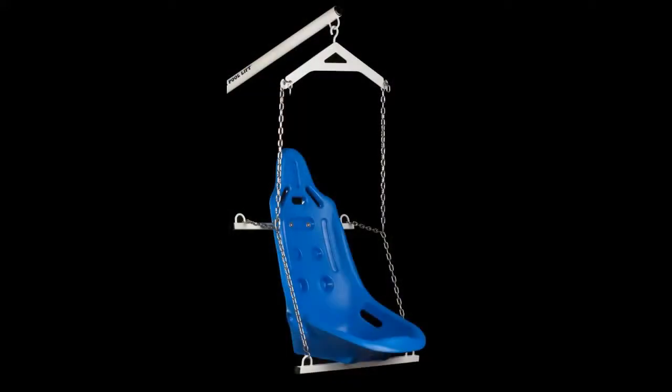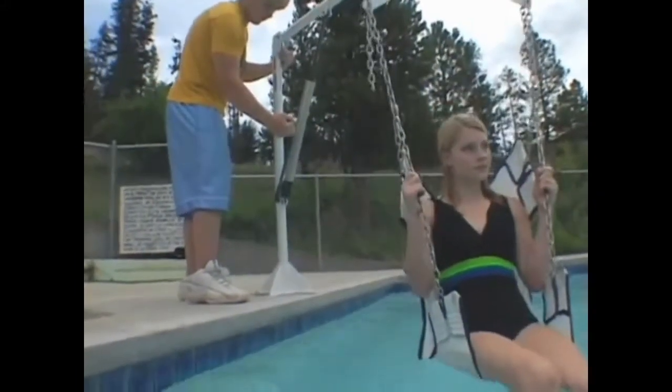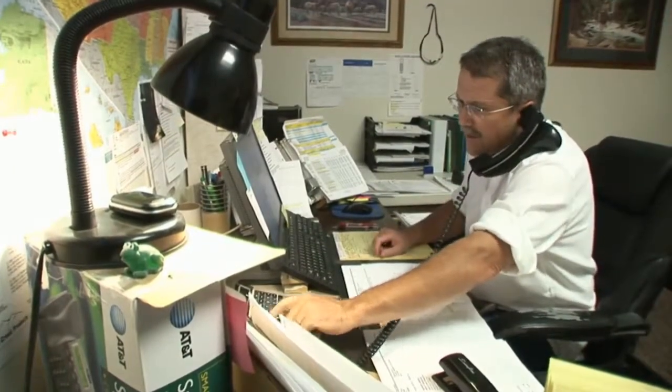An optional hard seat is also available. The Easy Lift comes complete with a lifetime structural warranty and a one-year limited hydraulics warranty, backed by Aqua Creek's outstanding customer service.